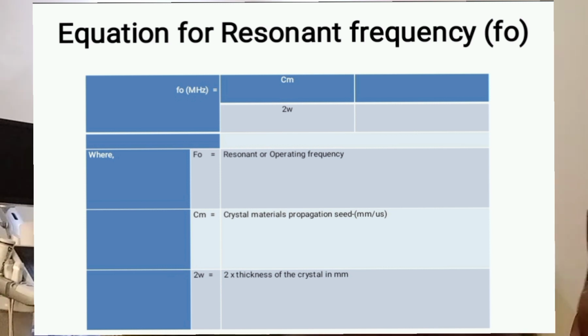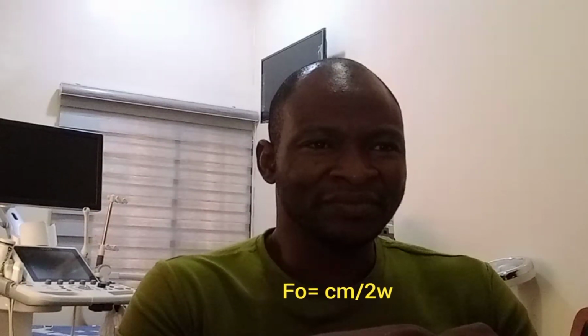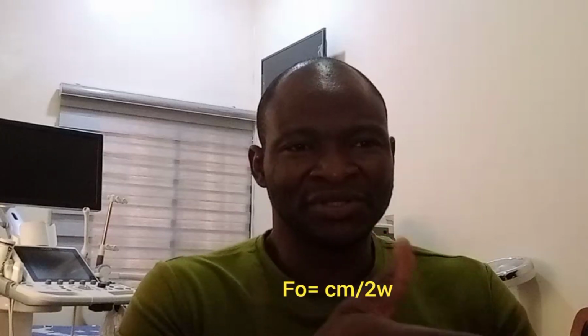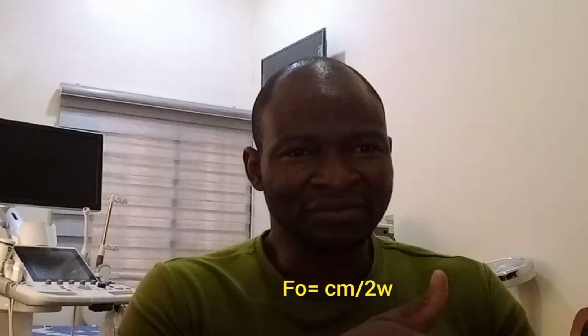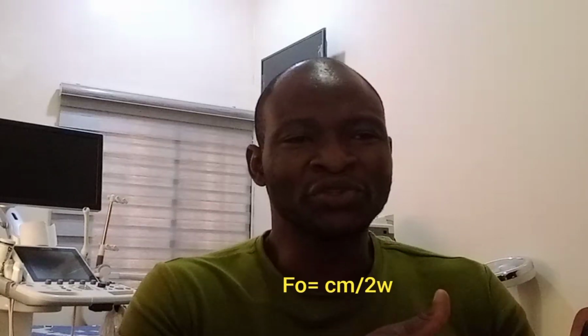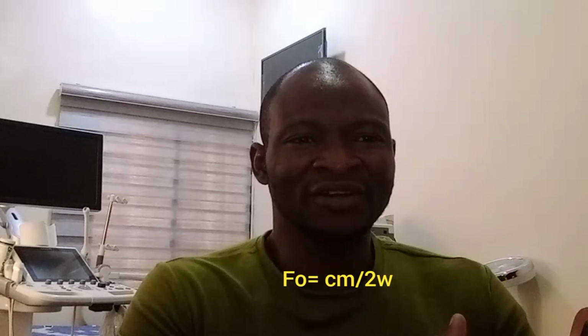So FO means resonant or operating frequency, C is the crystal material speed, measured in millimeter per microsecond. Then 2W, that is width, means 2 times the thickness of the crystal in mm.